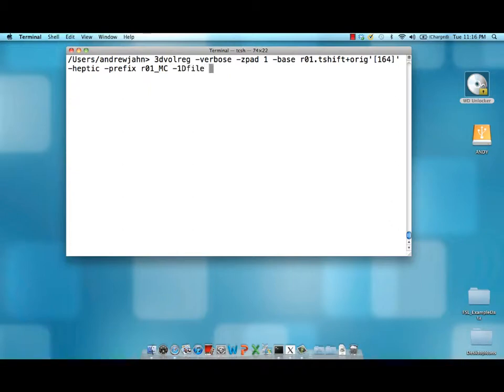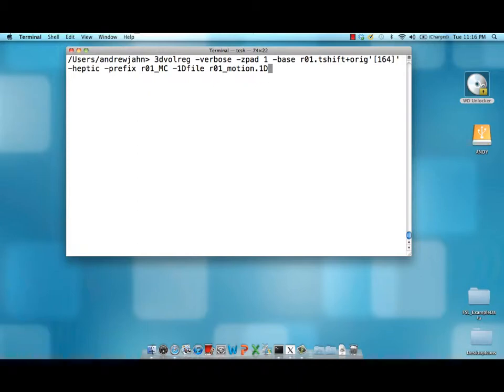1D file. This is going to output a motion parameter file. So how much did each volume move in both the x, y, and z directions and also in the roll, pitch, and yaw rotations.